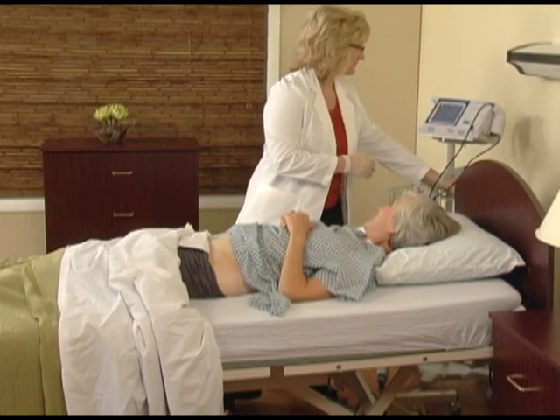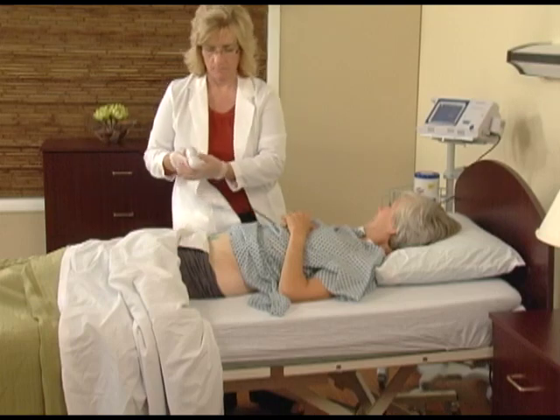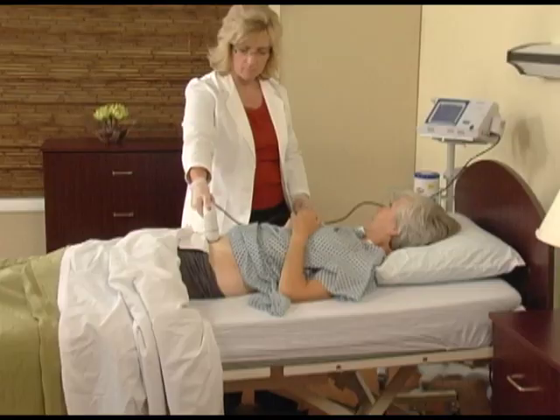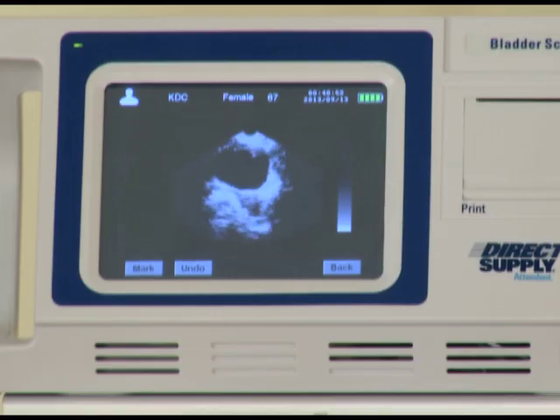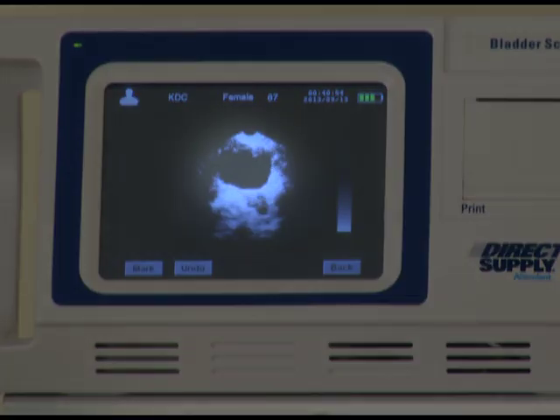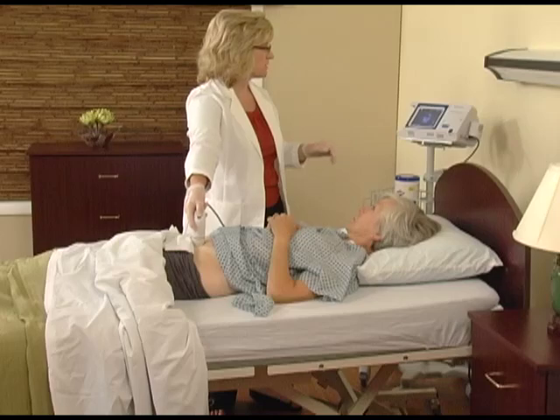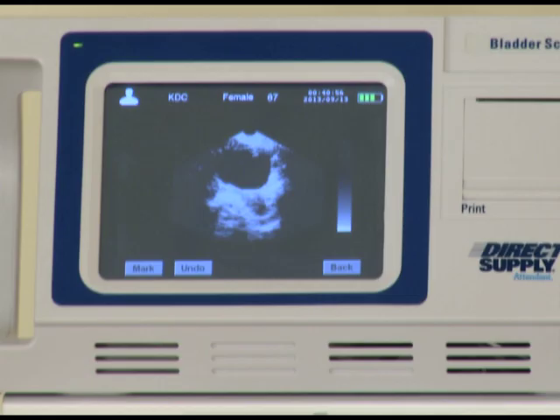Initiate the scan by placing the probe two inches above the pubic bone straight down. Apply a slight amount of pressure. Use the pre-scan feature to locate the bladder by pressing and holding the blue button on the probe. Slightly rotate the tip of the probe towards the resident's feet to maximize the view of the bladder. Bladder volume will appear on the pre-scan screen as a darker black image. Adjust the probe until the image is centered in the scan screen.